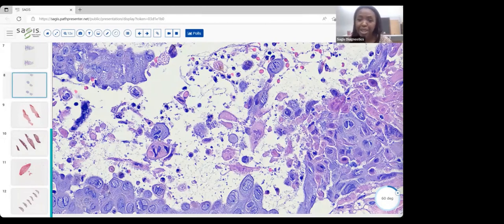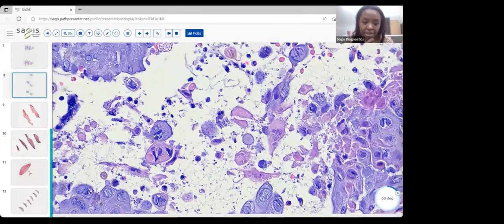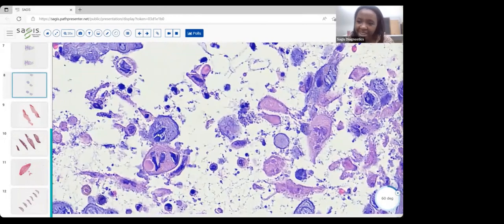Essentially, the cells are swelling, and the membranes between them are breaking down, so you get this multinucleation. Okay, and then looking at the nuclei as well, taking a close-up, these nuclei are conforming to each other. They're molding around each other. Okay, so this is what we call nuclear molding.